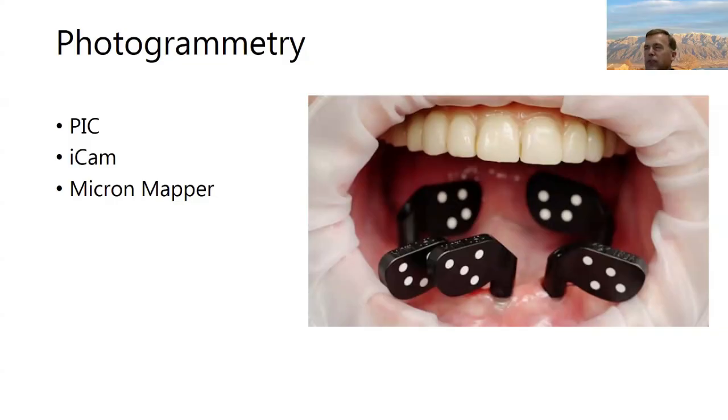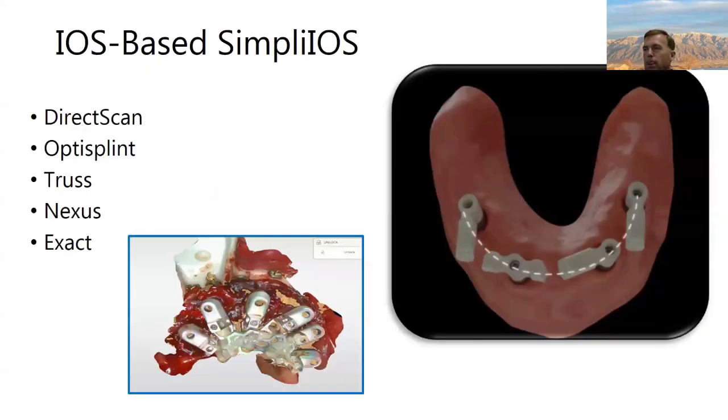The two drawbacks are that they're only good for capturing MUA position and they're kind of expensive. So you kind of need to decide if this makes sense in your practice. It'll definitely take fit off the table as a problem that you're dealing with, but you kind of need to decide if the volume of cases you're doing in your practice makes sense for that.